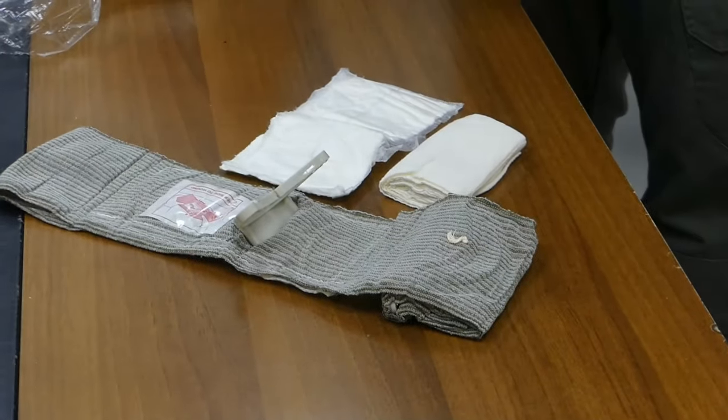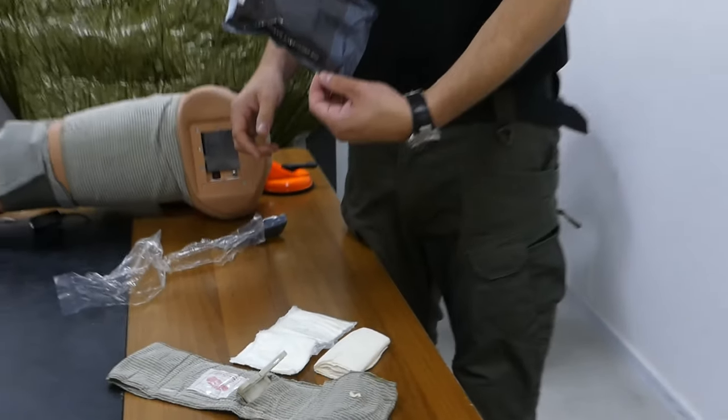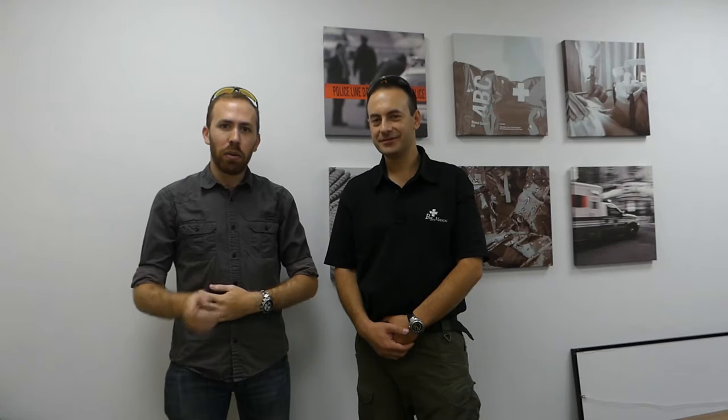What can also be added to the packaging is a set of gloves for the lay user. I want to thank Eddie from Persis Medical for all this information, and thanks to the National Center of Tactical Medicine for arranging this meeting.